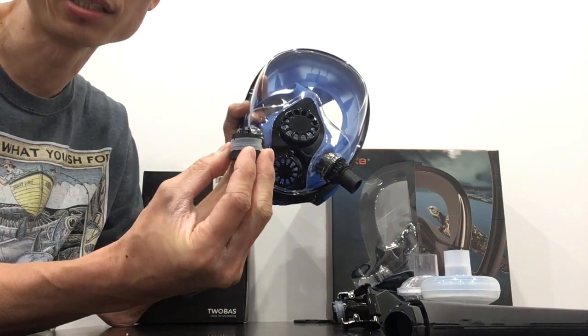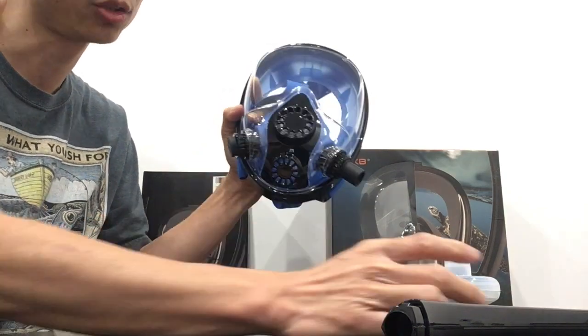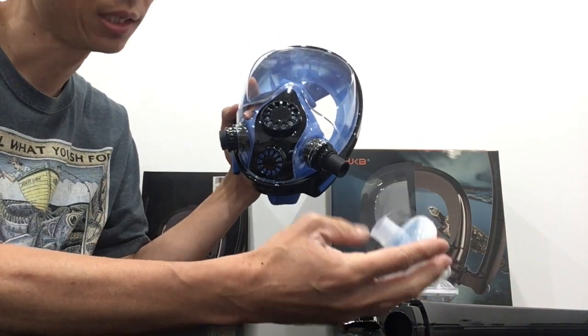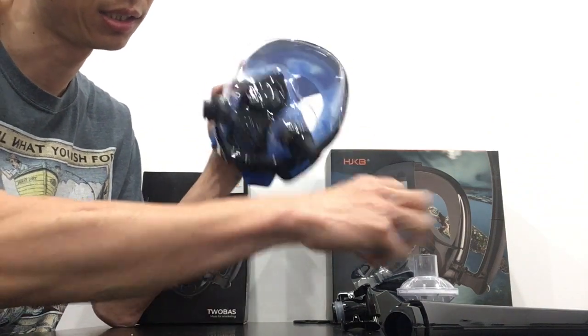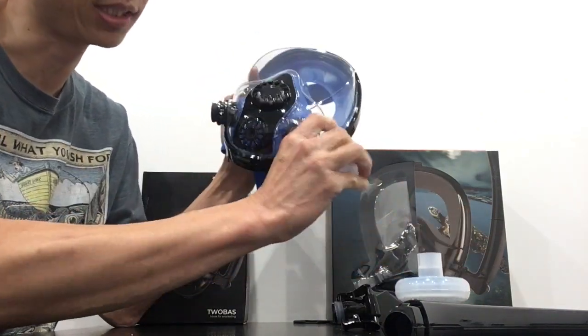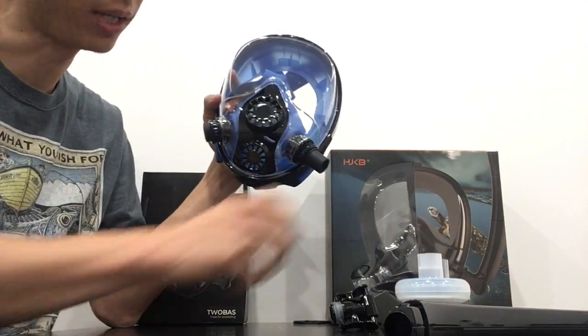We've also placed a plug on Thingiverse that you can use to plug the other portal if you only have one snorkel, one filter. The filter will fit directly onto the adapter, regardless of the adapter that you choose, and you can breathe through that.